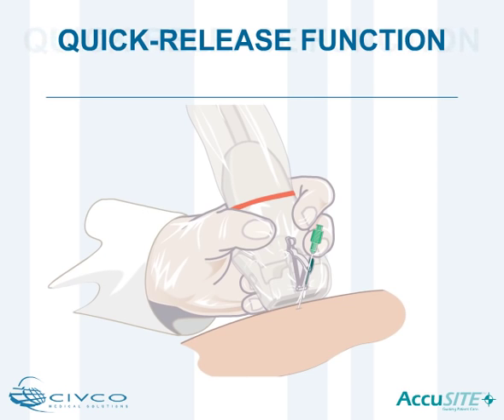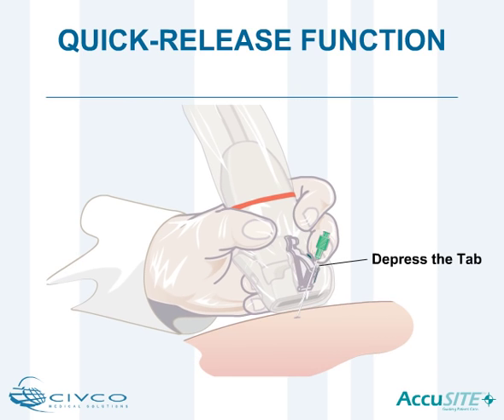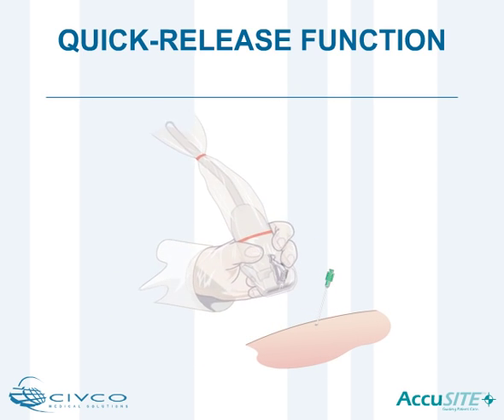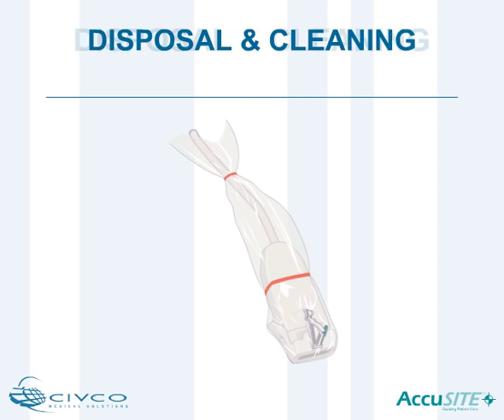The AccuSight needle guide allows clinicians to quickly detach the needle from the transducer during vascular access procedures. To activate the quick release, simply depress the colored tab and move the transducer away from the needle or catheter. Discard the single-use disposable components.